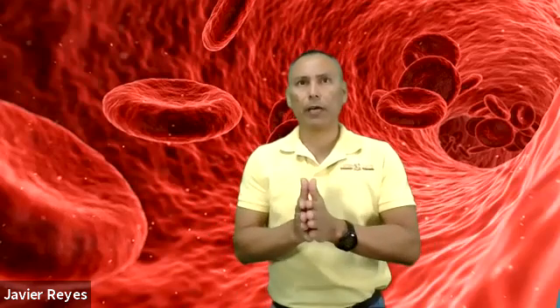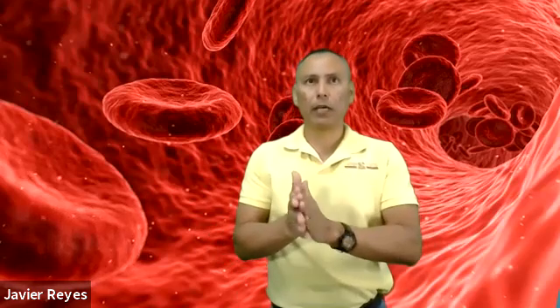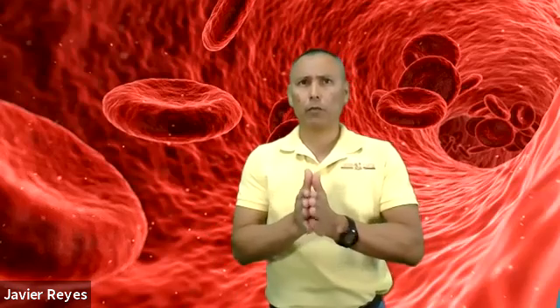I've talked about several H words. I've talked about hematomas, hemolysis, hemoconcentration. So here is where you have to be aware of these. One of the quality concerns is hemoconcentration. What causes hemoconcentration? The most common reason is dehydration, a decrease in fluid content of blood.